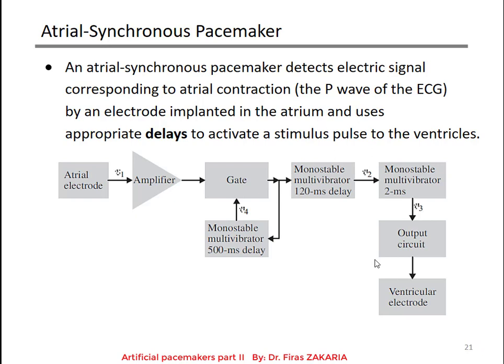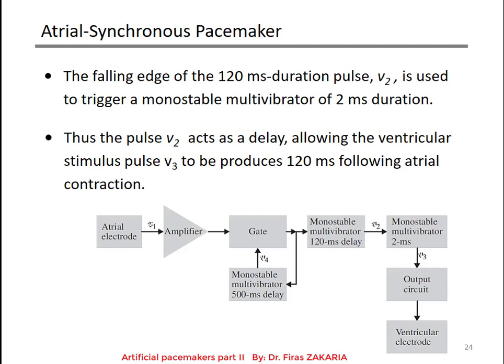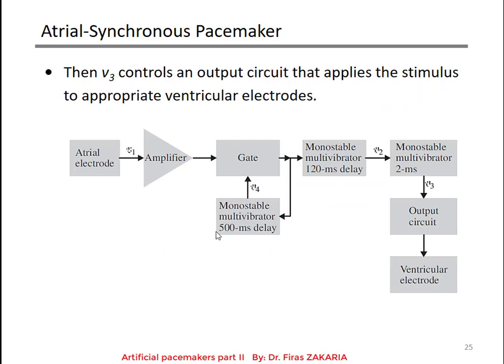This is concerning the Atrial-Synchronous Pacemaker. These monostable multivibrators are there to provide delays. Some discussions are illustrated here in the slides. You need to know the components of the block diagram and the function of each component of this atrial-synchronous pacemaker.